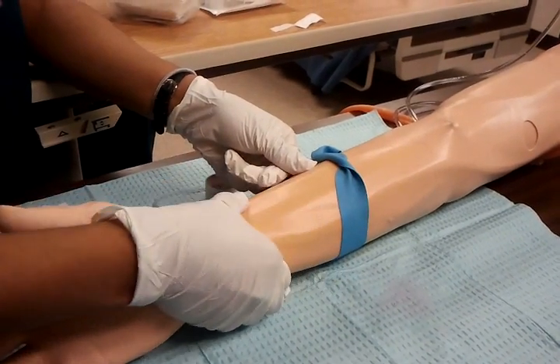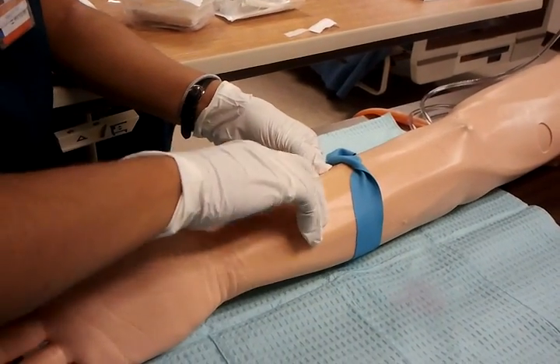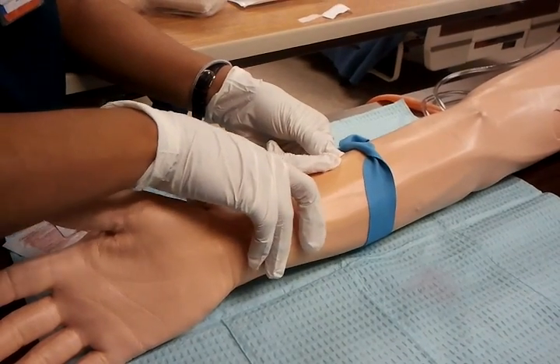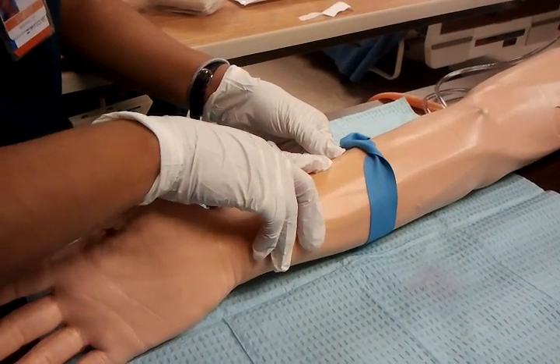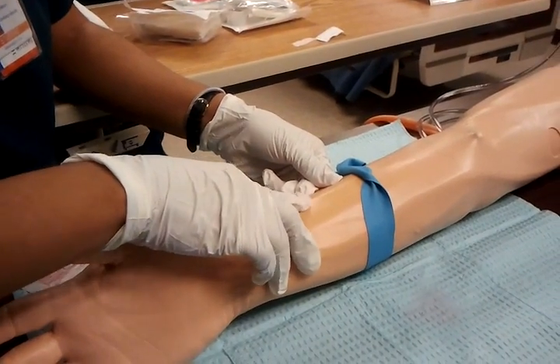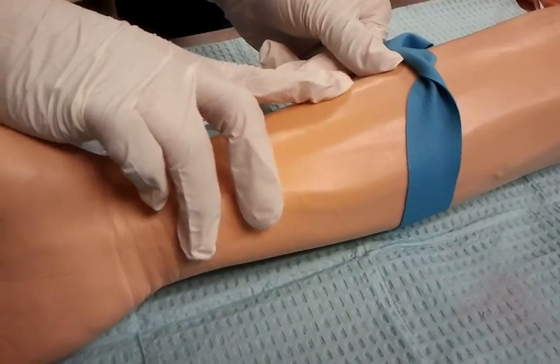Avoid areas that are painful to palpation. Select the site that will not interfere with ADLs. Avoid site distal to previous site, bruised area, or infiltrated sites. Palpate the vein for resiliency, softness, fullness, and spongy feeling.